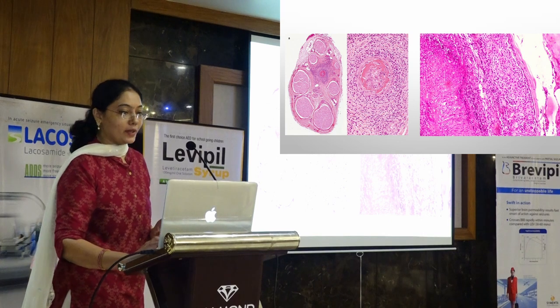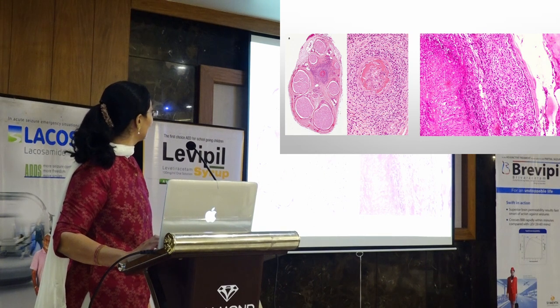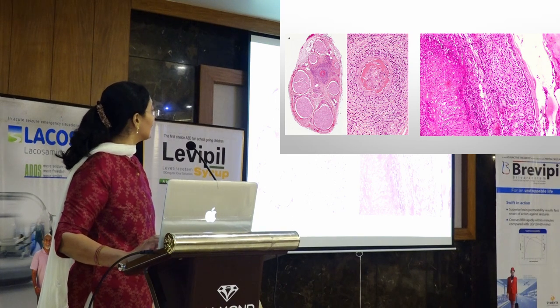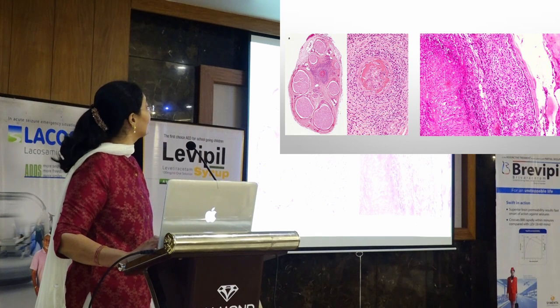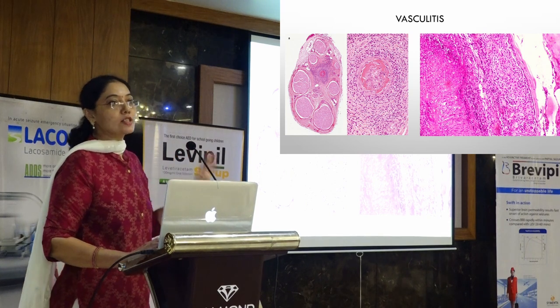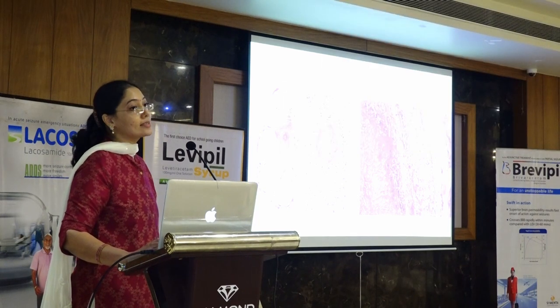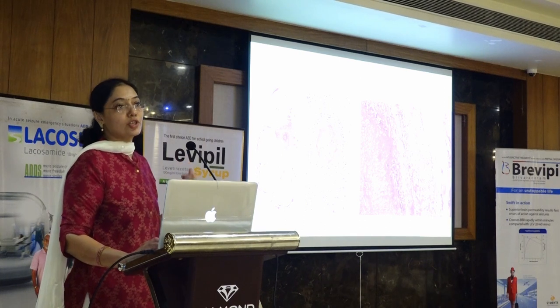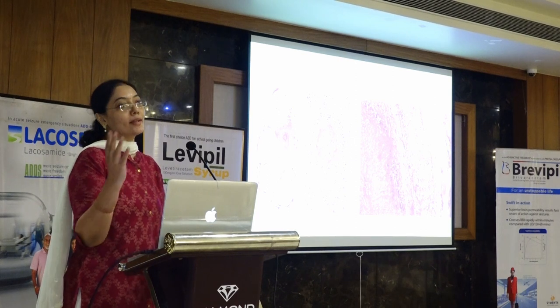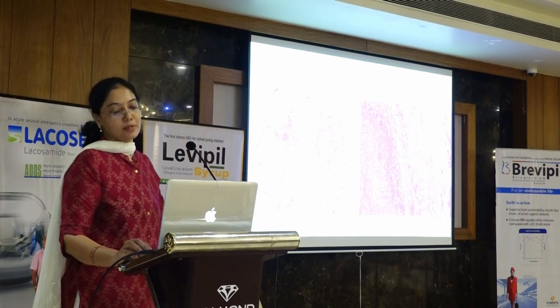This is a nerve biopsy in a case with mononeuritis multiplex. These are the fascicles of the nerves. There is destruction of the vessel wall with fibrin-like pink material — fibrinoid necrosis — and surrounding inflammation. This is frank vasculitis. Another case had fibrinoid necrosis as well as eosinophils, with eosinophilic degranulation and tissue destruction by eosinophils — this actually belonged to Churg-Strauss syndrome. The clinical criteria has six points of which at least four have to be met; this case met all of them. Can I give a definitive diagnosis? Absolutely — vasculitic neuropathy.